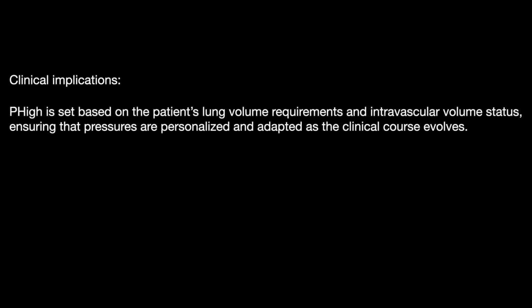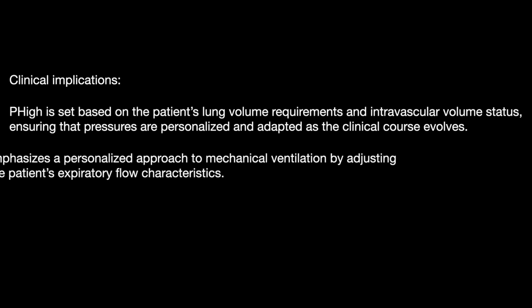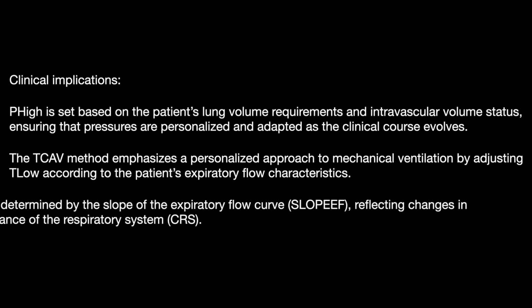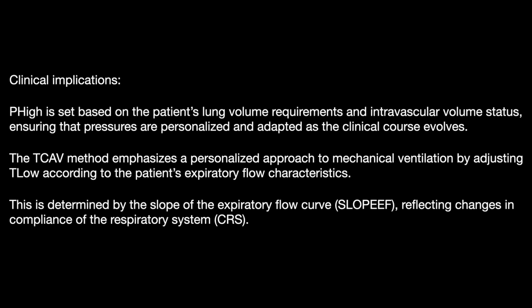What is the clinical implication? The P high is set based on the lung's volume requirement and the intravascular volume status, ensuring that the pressures are personalized and adapted as the clinical course evolves. However, the time-controlled approach emphasizes adjusting the T low to keep the expiratory flow characteristics constant. This is determined by the slope, as we have already discussed.